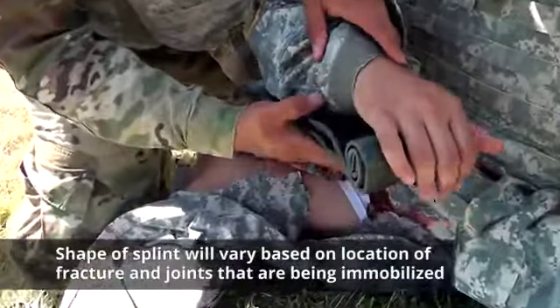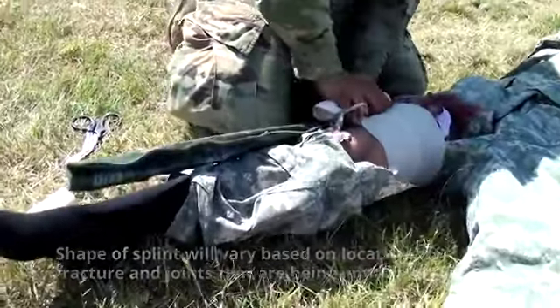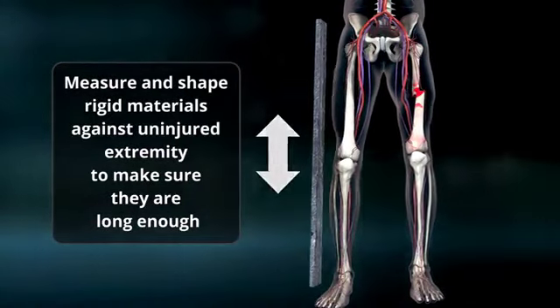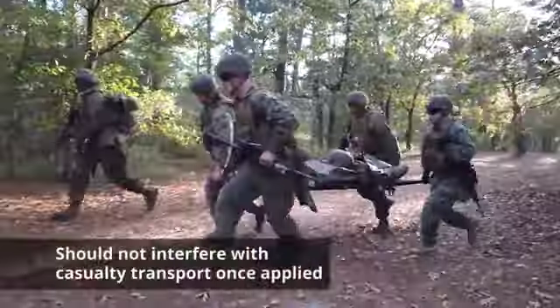The shape of the splint will vary based on the location of the fracture and the joints that are being immobilized. If a malleable splint isn't available, then measure and shape rigid materials against the uninjured extremity to make sure they are long enough, but not so long that they will interfere with casualty transport once applied.